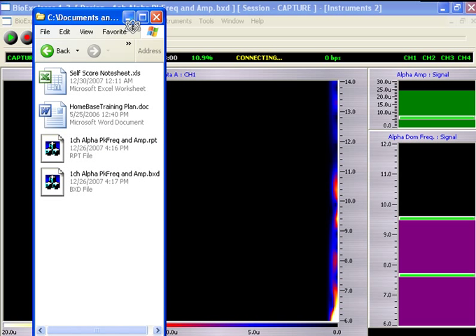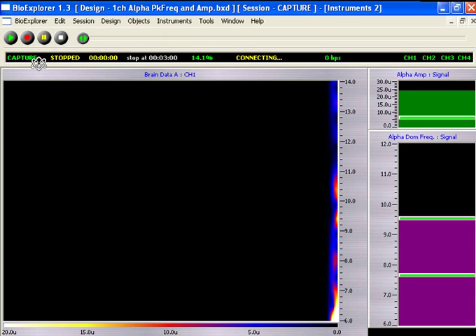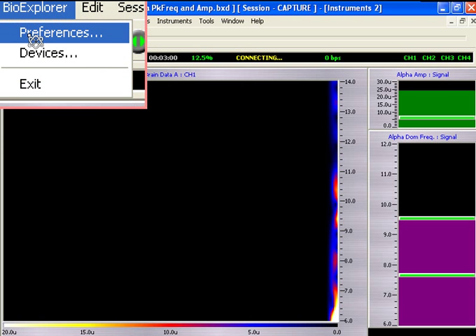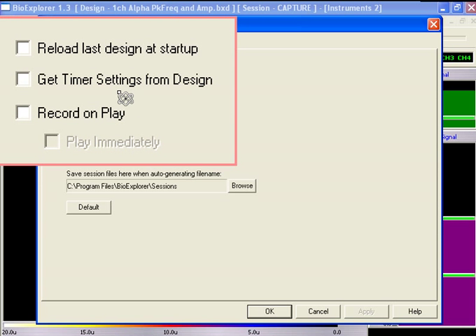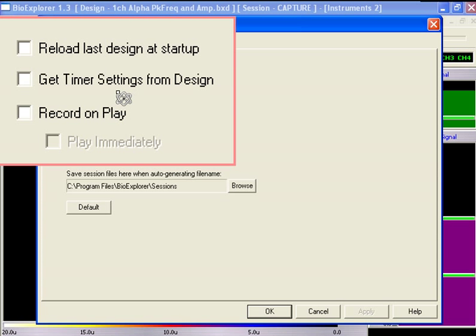In the Bio Explorer menu, click Preferences. Get Timer Settings from Design sets the condition length according to the design we've loaded.